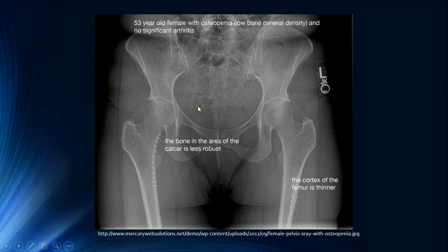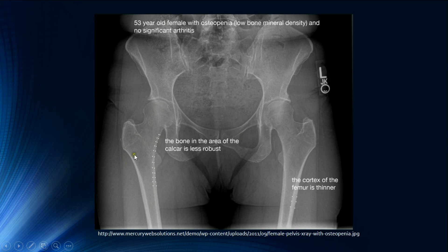Here we have an example of osteopenia. We can see thinning of the cortex of the long bones and slightly increased lucency of the medulla of the long bones as well.